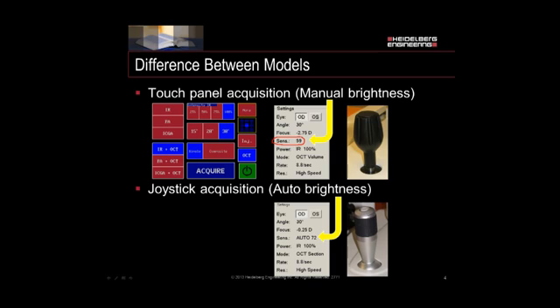The other model, the OCT-only model, uses the joystick for acquisition, with a button on top of the joystick. Brightness is set to automatic — it's controlled through the device itself, whereas on the touch panel it's controlled by the user. To turn on the tracker on the touch panel model, press the black gain control button. For the joystick model, hold the joystick button down for one second to activate the eye tracker, then press the joystick button quickly once to start acquisition.